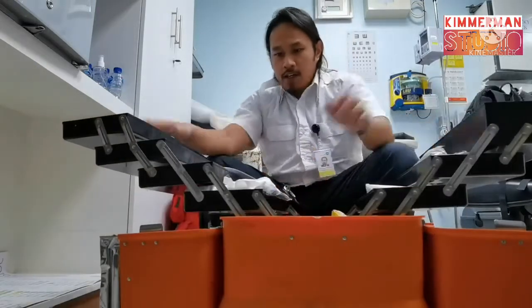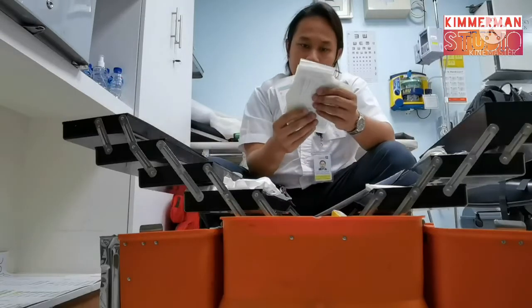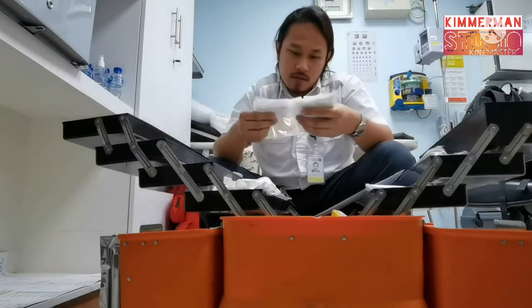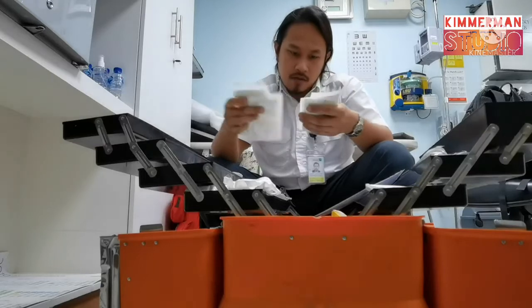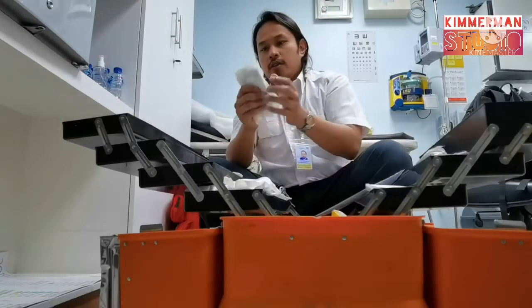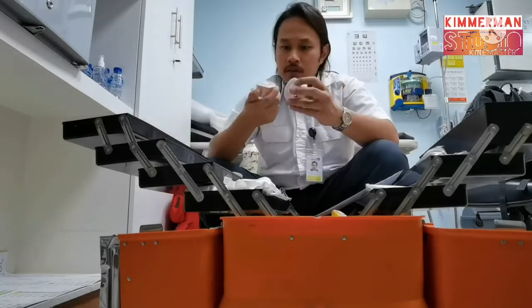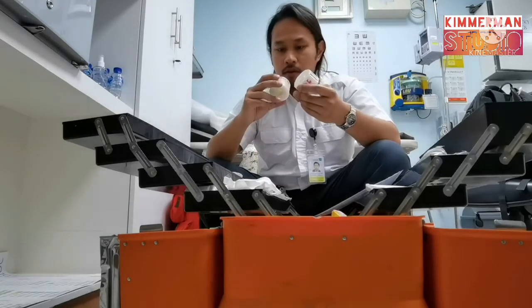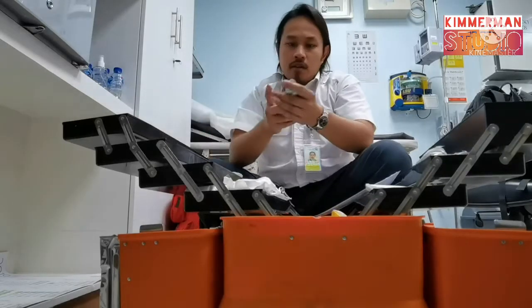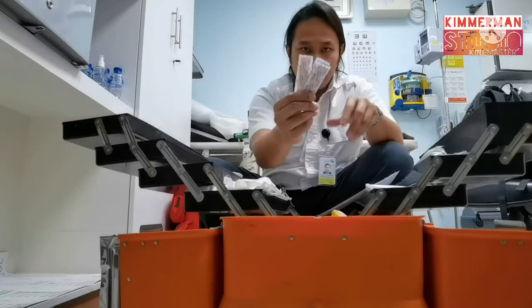So now we're going to the right side. On the right side, we have four shelves here. First shelf, we have Tegaderms. Okay. All are good, not expired. We have the zinc plasters. Not expired. We also have alcohol swabs again, and Band-Aids.